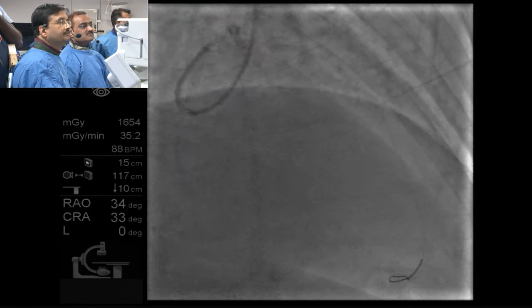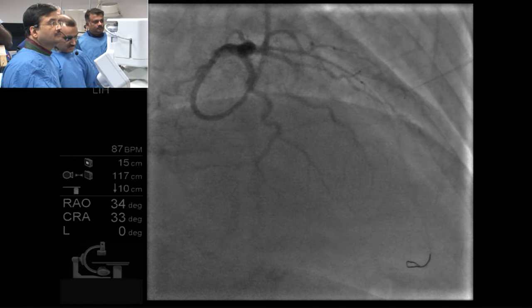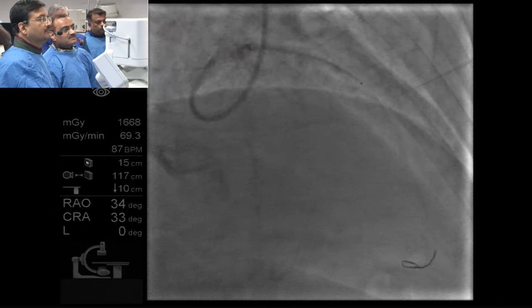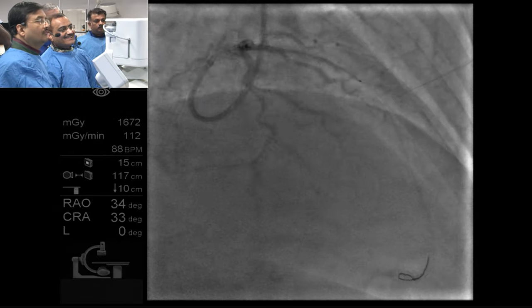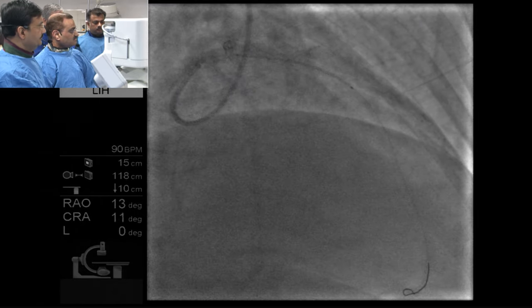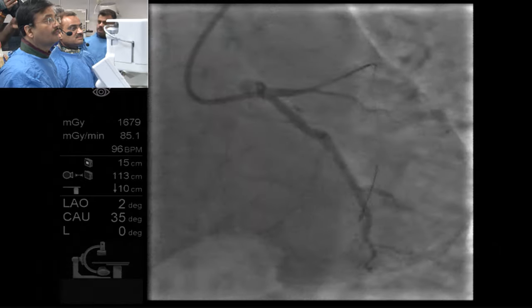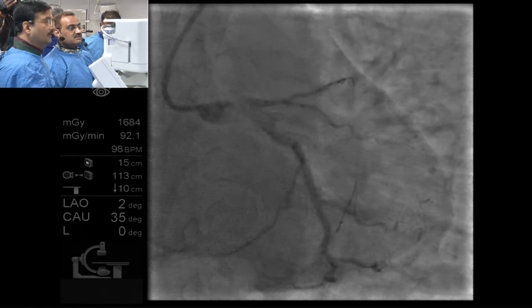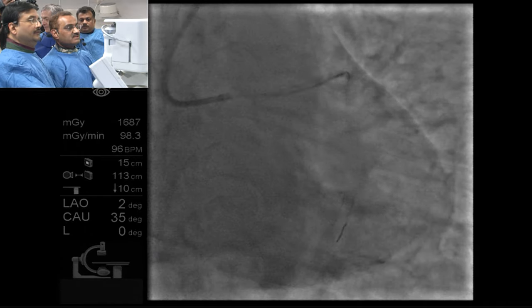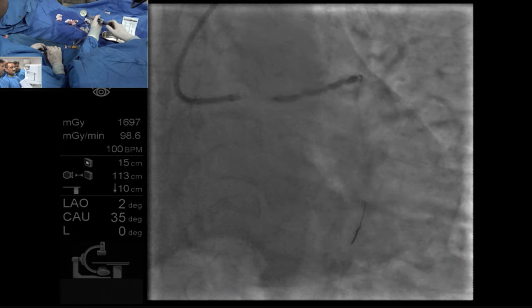The gods are with him. Exactly. I prayed enough. Why not just do an extra step to prep the lesion better, then deploy the stent? I think certainly for the young operators, that would be a small thing to do. Make sure that your balloon is opening. Prep your lesion well so your stent goes down. And that's an excellent advice. You just want to make it a shortcut: 14, and then 16, you regret it. 18. I think the worst thing to have is a stent that's only half deployed.